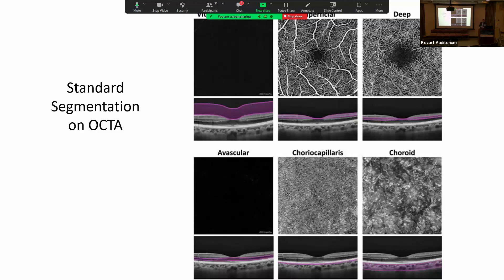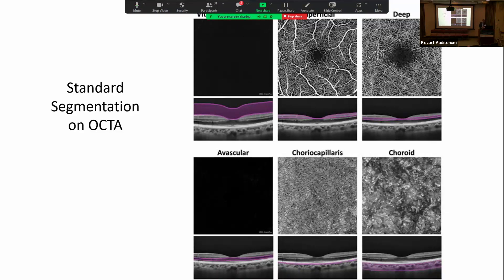This is the standard segmentation we get on OCTA. The vitreoretinal interface segment corresponds to the vitreoretinal interface and is useful for characterizing neovascularization from diseases such as diabetic retinopathy, where neovascular fronds grow in the sub-hyaloid space. The superficial and deep capillary plexi and the avascular segment we already discussed, then you've got the choriocapillaris and the choroid, including Sattler's and Haller's layers.